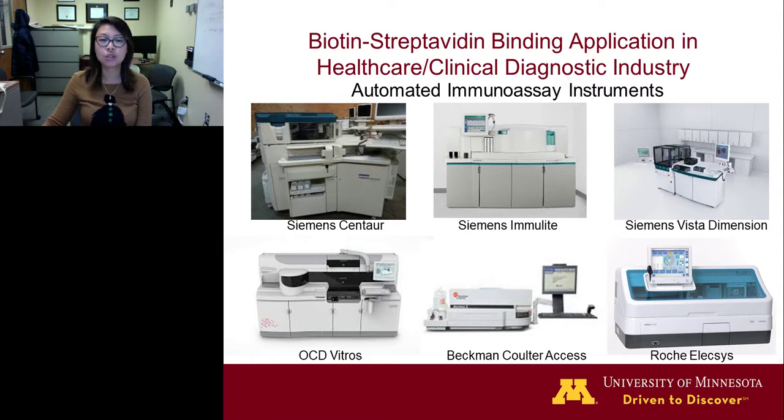So here is a list of the major diagnostic instruments used in our clinical lab that use biotin and streptavidin binding. I will talk about the mechanism of how biotin interferes with assays on those instruments later.